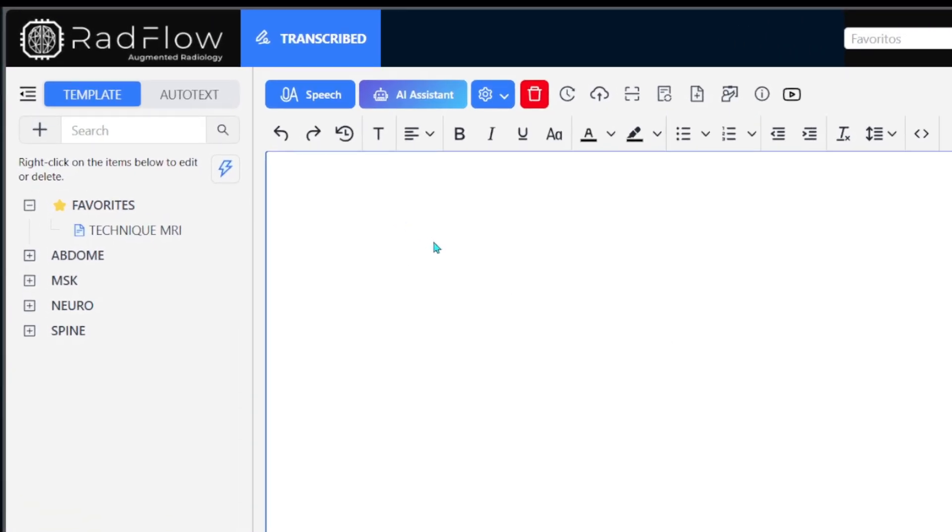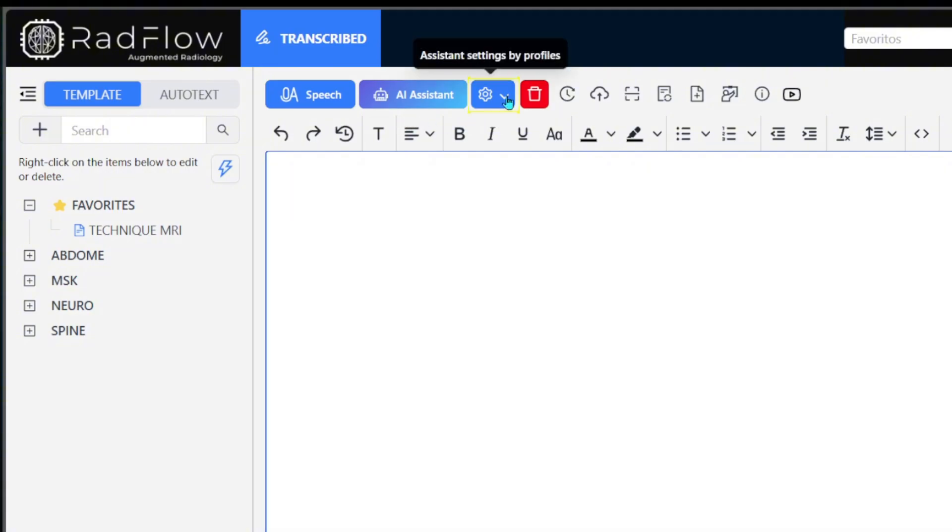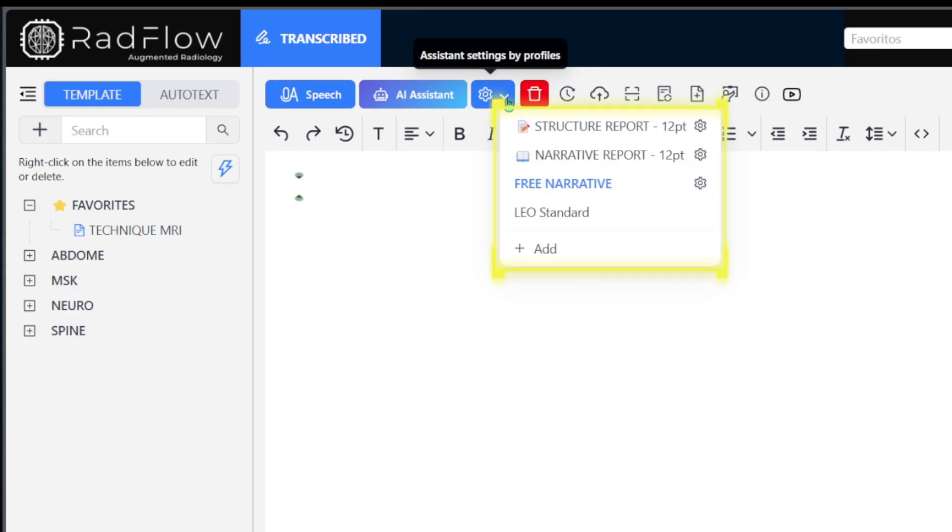At the top of the screen, you will find the two main options for text generation, the Speech AI Microphone and the AI Assistant. Before using these features, it is important to configure one of your assistants. Click on the down arrow next to the Settings icon and select Add a new assistant.